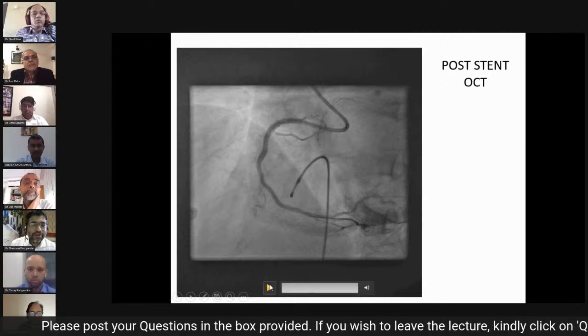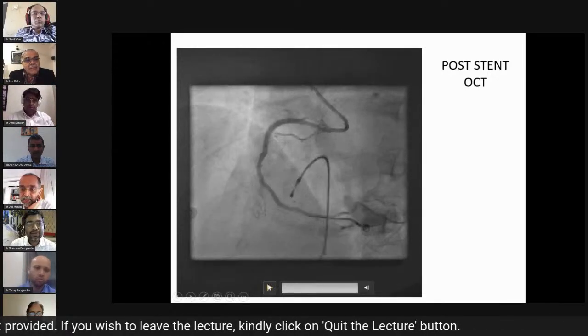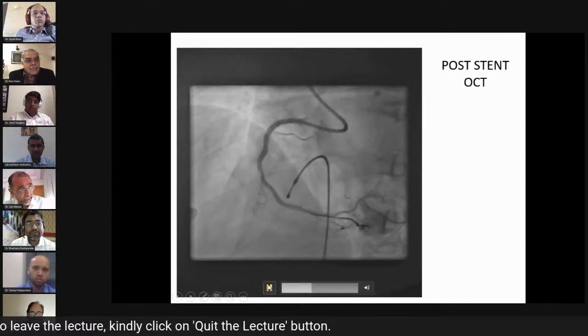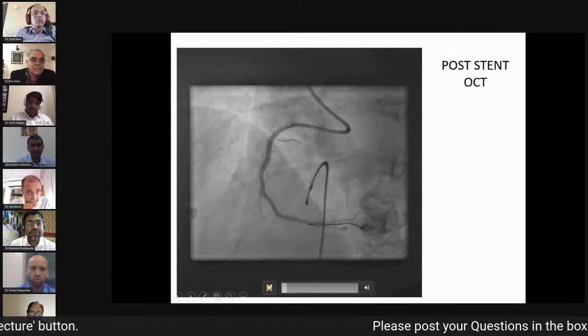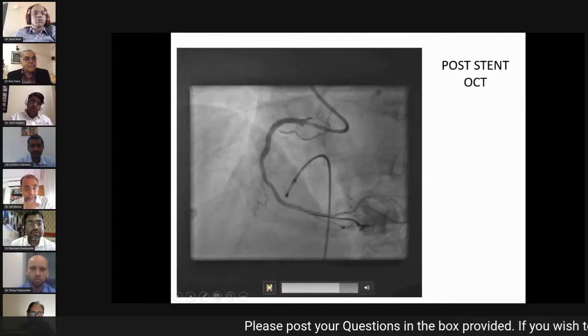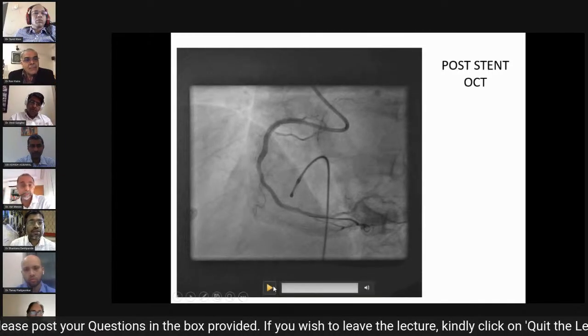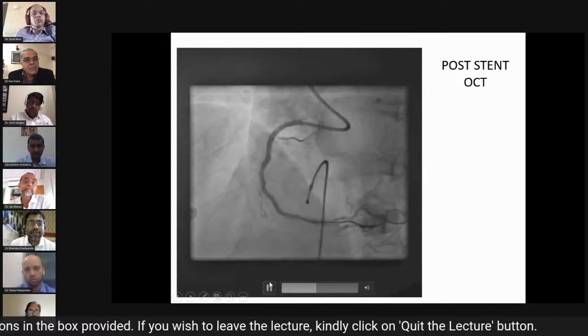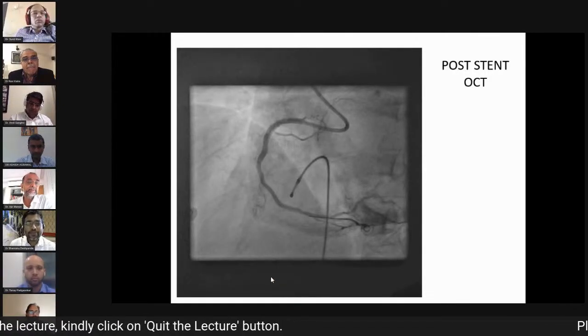I think it will be very difficult to visualize on OCT. No, I don't have the film with me right now, but Amal will have it. We have a case where in the left main we can actually see that because the calcium was on one side, the balloon dissected and went almost beyond the media on one side. Yeah, okay. That India Live case. Yeah, exactly. Yes.